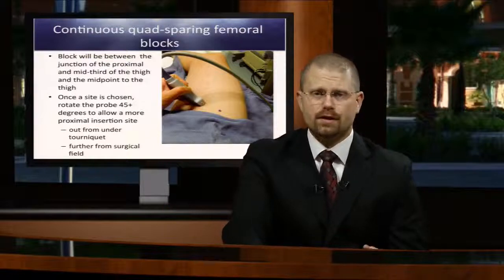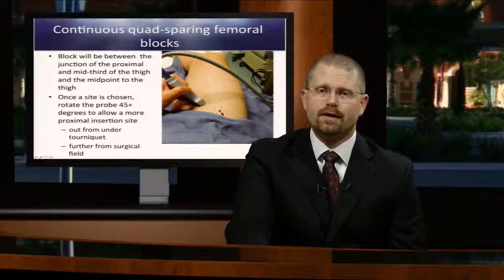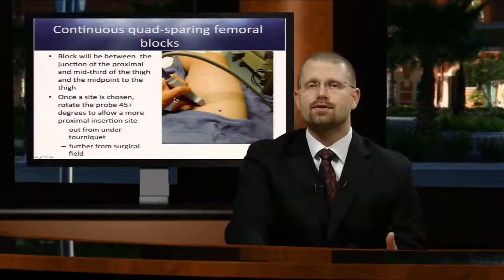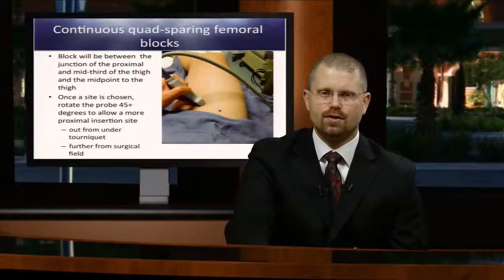I usually use a 4-inch needle for this. Try to maximize and get a full 10 centimeters from here to where you're doing your block, or as close to it as possible. This will give you a more proximal insertion site, and your surgeon will thank you, or at least won't yell at you.